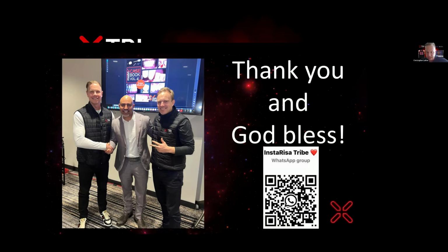This also is how to improve the implant system, the emergence profile, talking about crowns. This is from Jorge Modica. How does it improve the emergence? Well, one of the things that's nice is that you have the ability to print out a custom healing abutment. And when we say custom, it could be shaped like a tooth, or it can be shaped as a healing abutment. So that emergence profile is immediately created on the day of surgery. The other thing is that as a result of the width of that platform, you're not coming in from a narrow platform switch diameter, you're coming out wide from that concave surface. So you have a better emergence profile compared to some of the implants that have a platform switch.